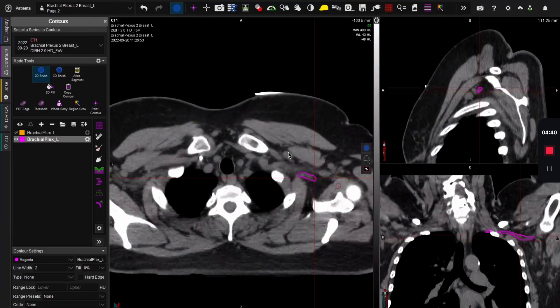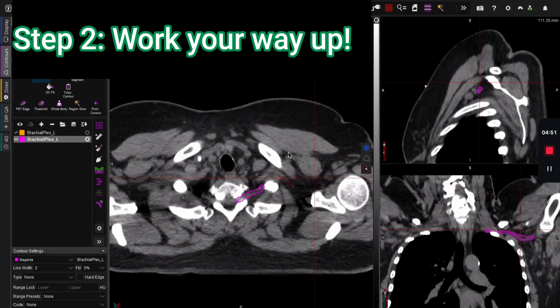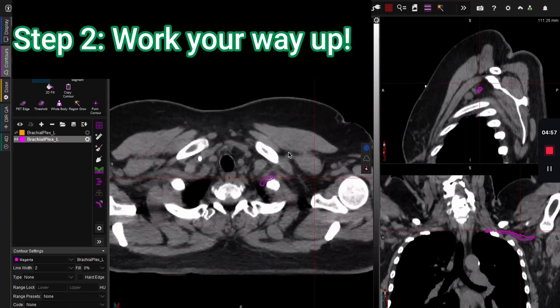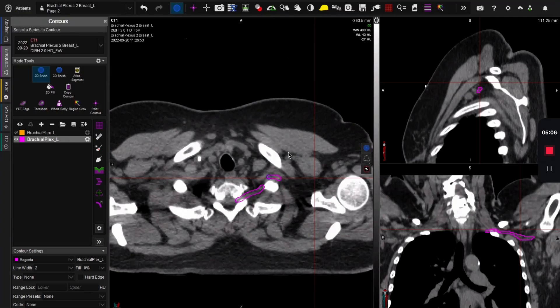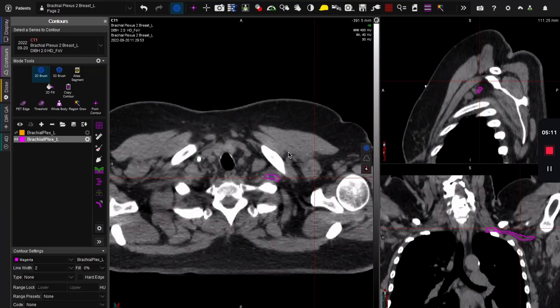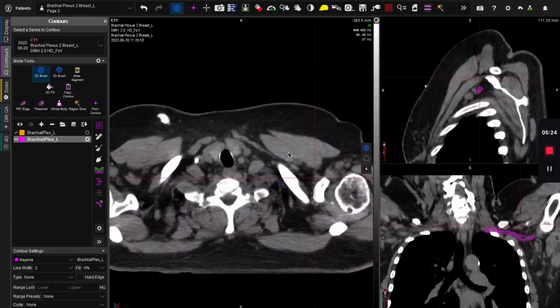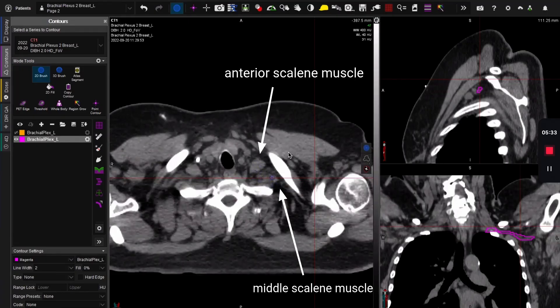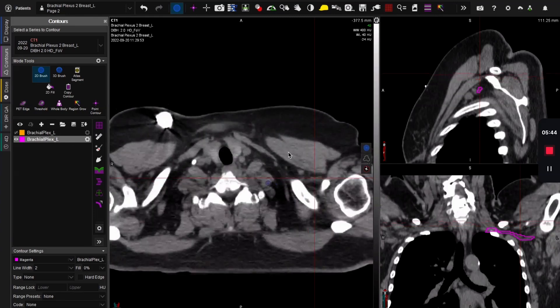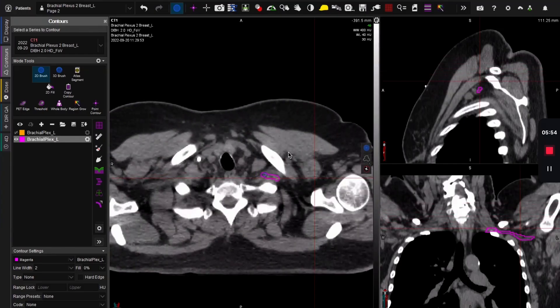So we've done the hardest part — good job. The next step is working your way up, which requires a little bit of refining. Remember that the brachial plexus is a continuous structure. The important thing to remember is that the brachial plexus goes between the anterior scalene and the middle scalene muscles. As I scroll up, you can see there's this blob and then this blob — this is the anterior scalene, this is the middle scalene, and there's this little passageway in between. That's where the brachial plexus sits, and it keeps following up until it gets to C5.